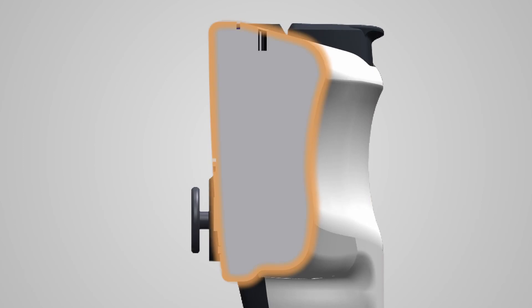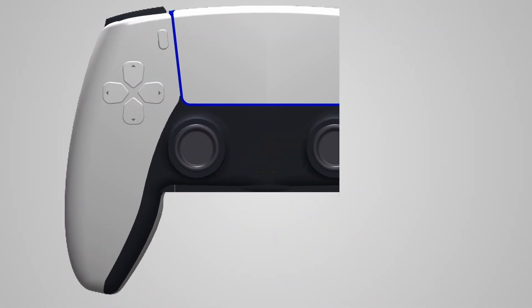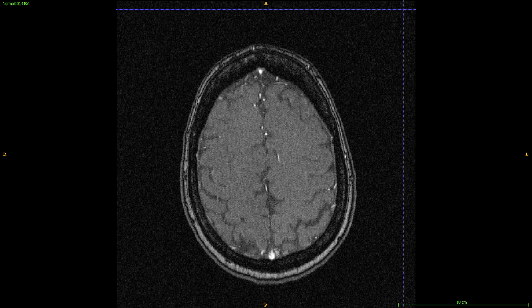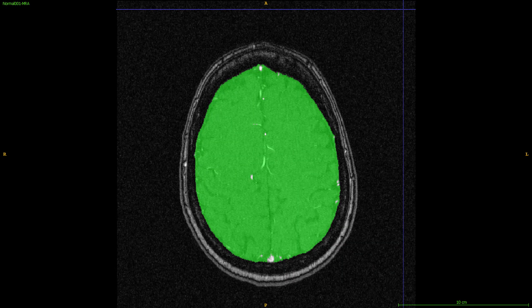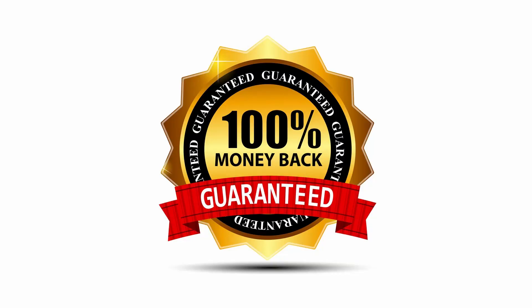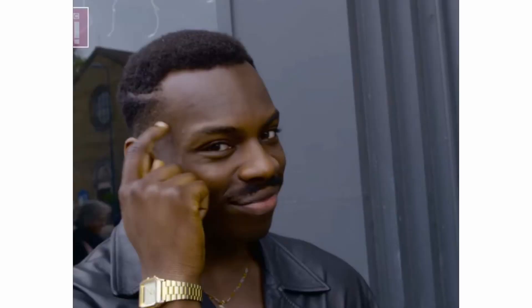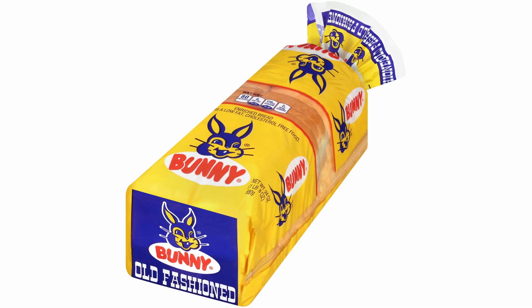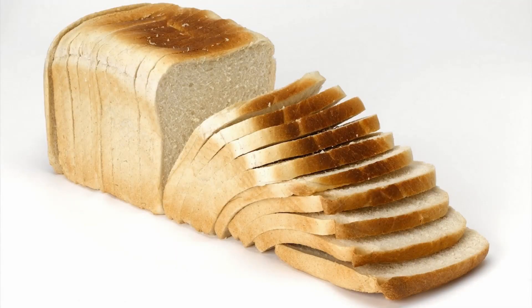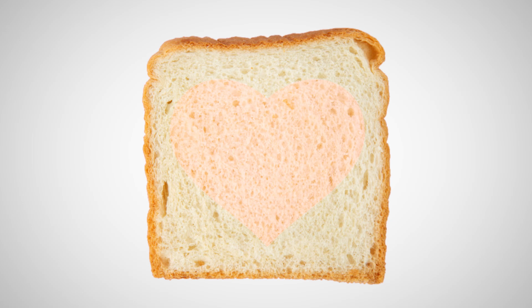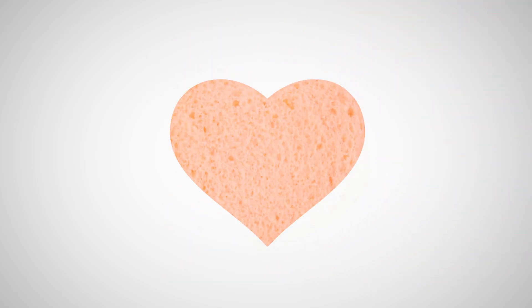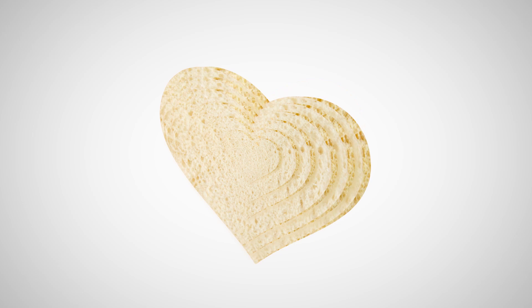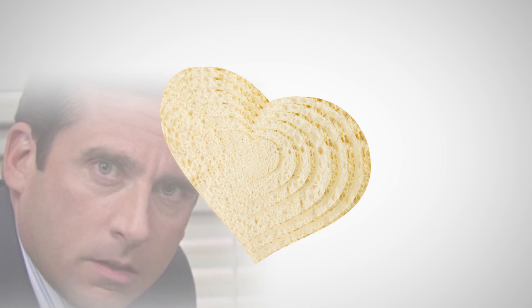Your goal is to take something from these scans and reconstruct it into a 3D shape. This process is done by coloring the region of the scan that you want, moving to the next slice, and then the next, and so on. The most foolproof way to visualize this is to think of the set of scans as a loaf of bread, with each slice representing a single scan. As you color each scan, the surrounding part of the bread is removed, gradually revealing a 3D bread sculpture.